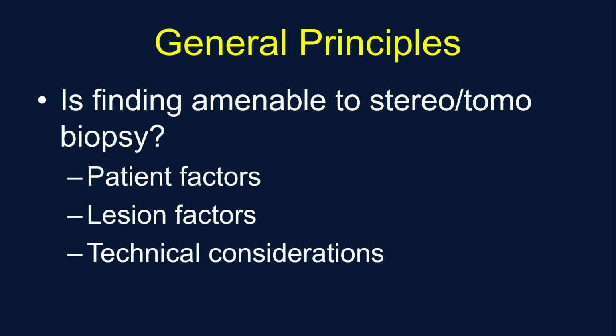Can the patient come off anticoagulation? Now, some people have done these biopsies when somebody's on Coumadin. I don't usually recommend that, but there was one study that came out saying that the major complication rate was actually pretty comparable doing this on or off anticoagulation, but I would worry, obviously, about a large hematoma in that setting. In terms of the lesion, is it really approachable?